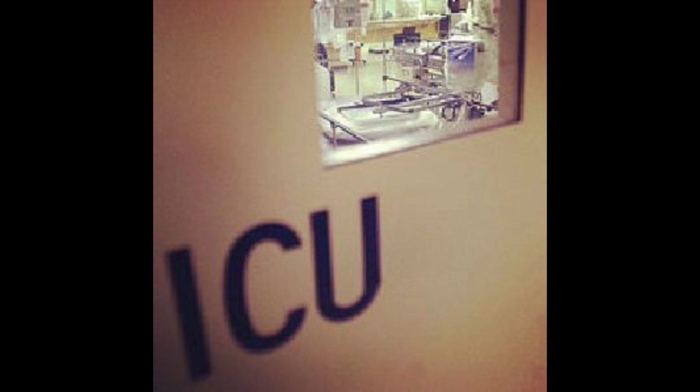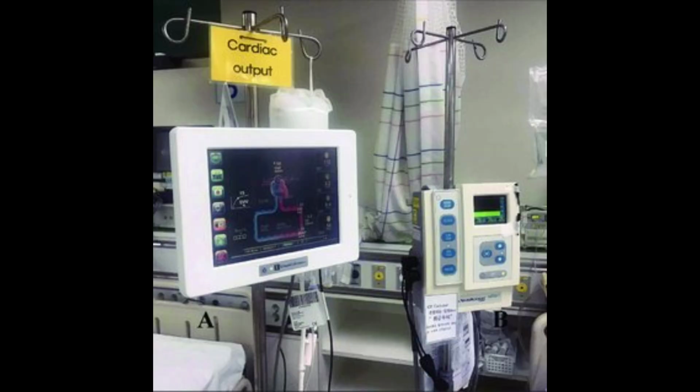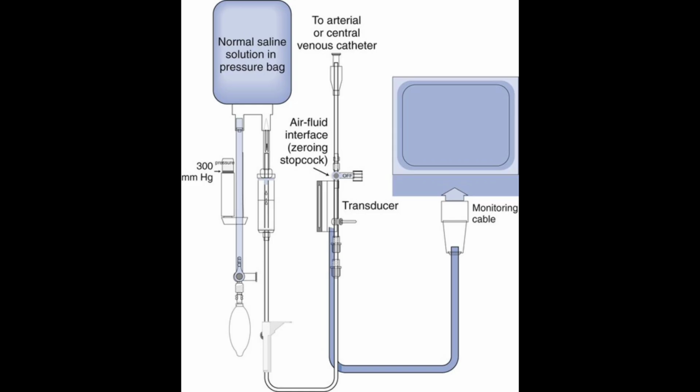Invasive hemodynamic monitoring allows us to closely measure a patient's blood pressure, fluid volume, and heart function using specialized catheters placed in arteries or veins. It's commonly used for critically ill patients who need precise cardiovascular assessment to guide treatment.